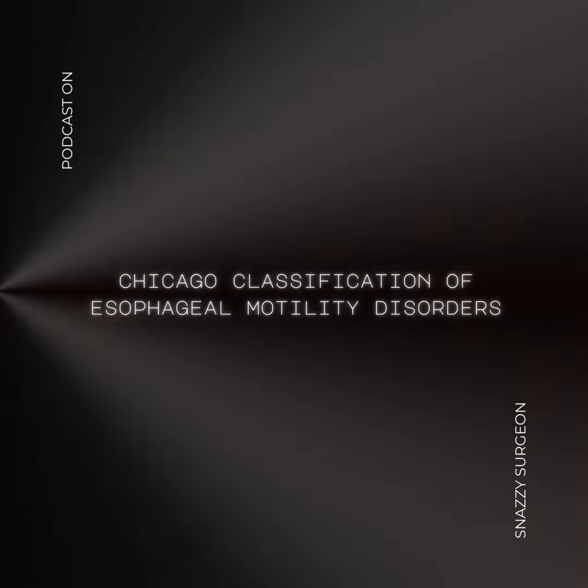What about DCI? Distal contractile integral, or DCI, tells us about the strength, the duration, and how much the distal esophagus is involved in the contraction. We calculate it by multiplying the contraction's amplitude, how high the pressure peak is, by its duration, how long it lasts, and by the length of the esophageal segment where the pressure is over 20 mmHg, starting from the transition zone all the way down to the top of the LES. The units are mmHg·s·cm. It basically tells us how much oomph that contraction has, how powerful it is over a certain time and distance.